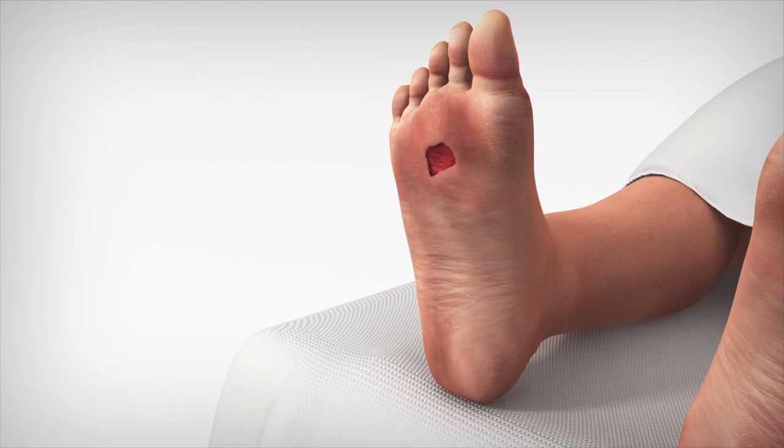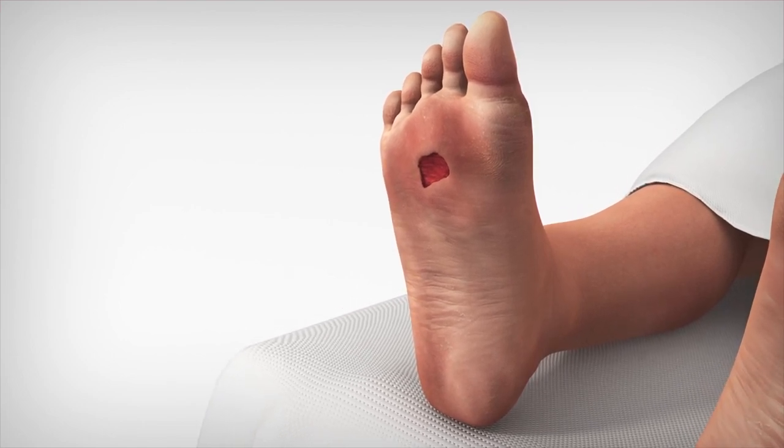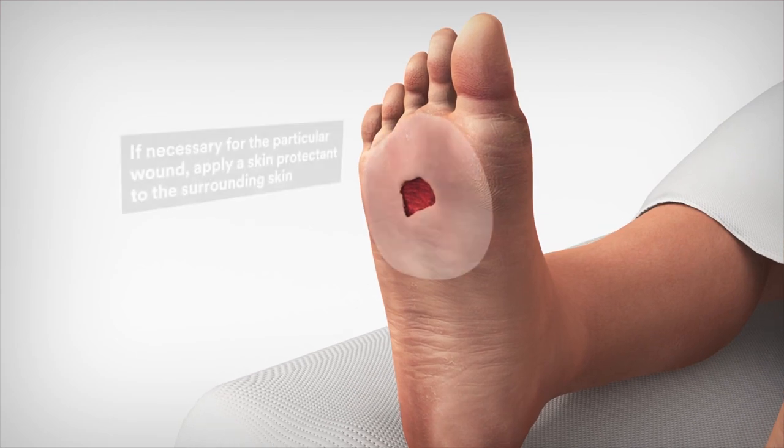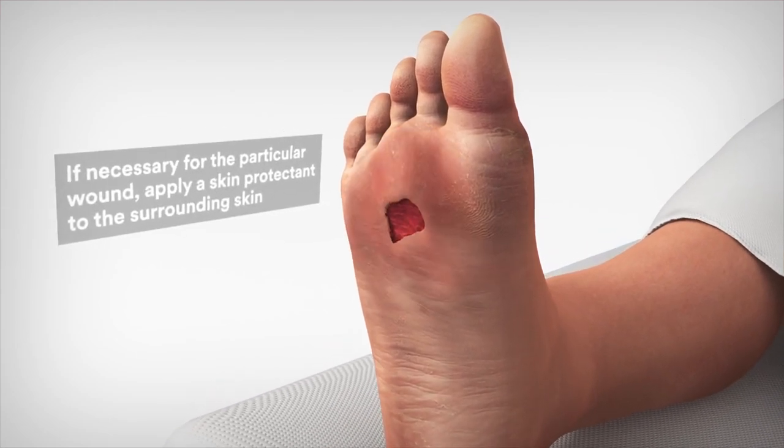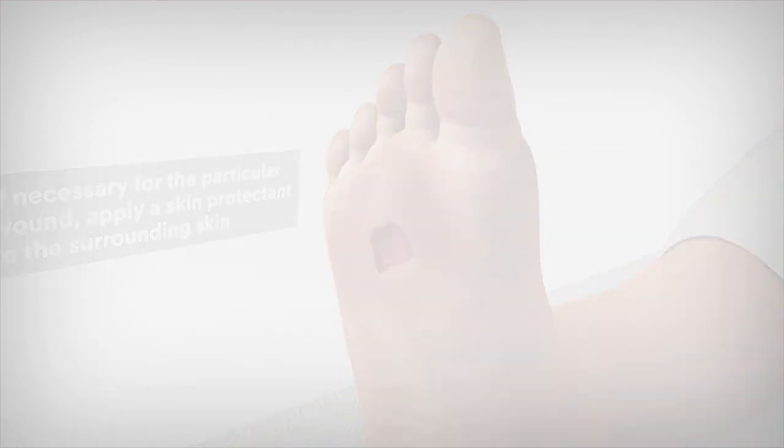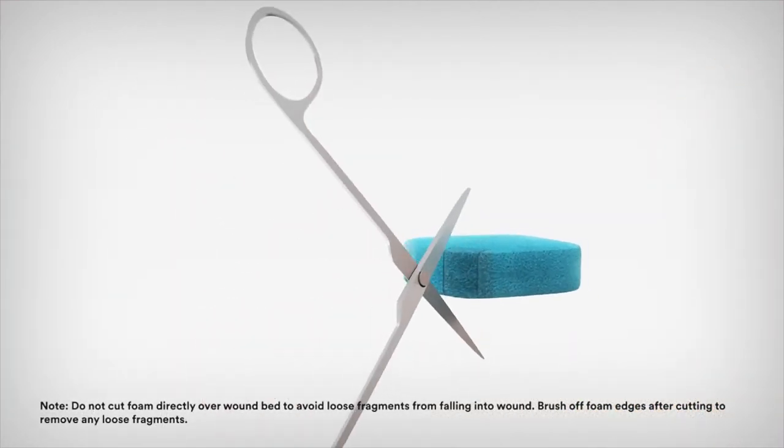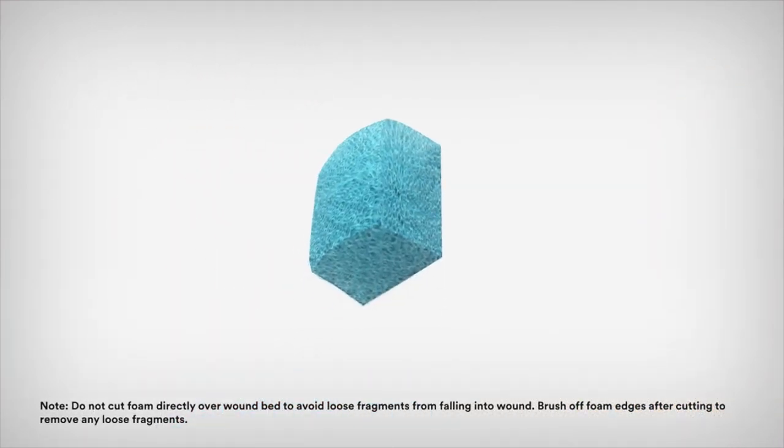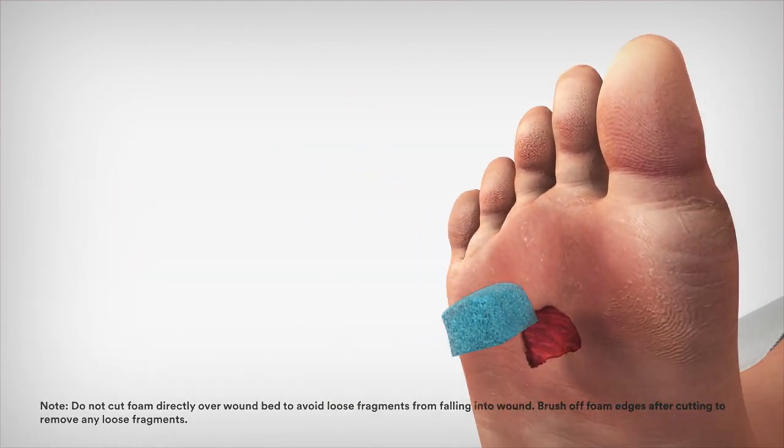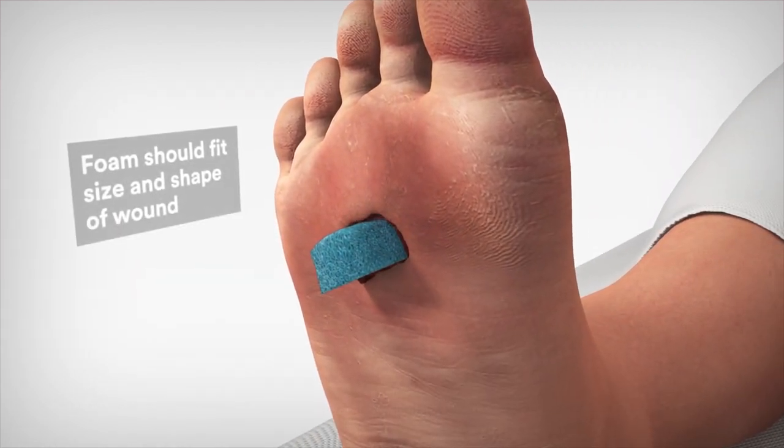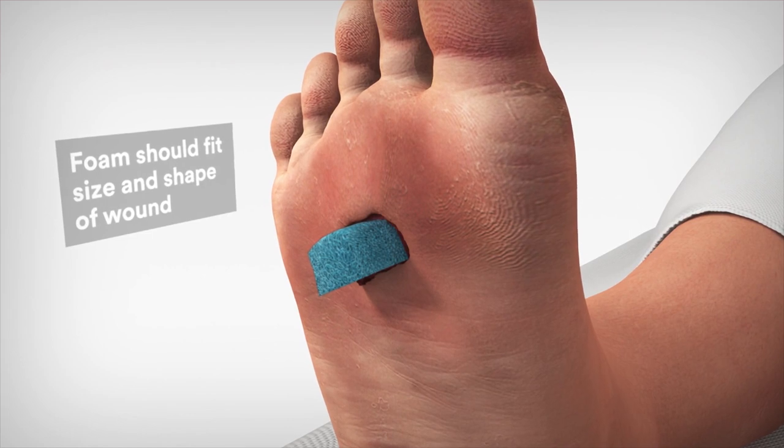Begin by preparing the wound bed and peri-wound skin per institutional protocol. If necessary, apply a skin protectant to the skin surrounding the wound. Next, cut the foam to fit the size and shape of the wound. Place the foam into the wound cavity, making sure the foam fills the wound cavity and extends above the wound margins.